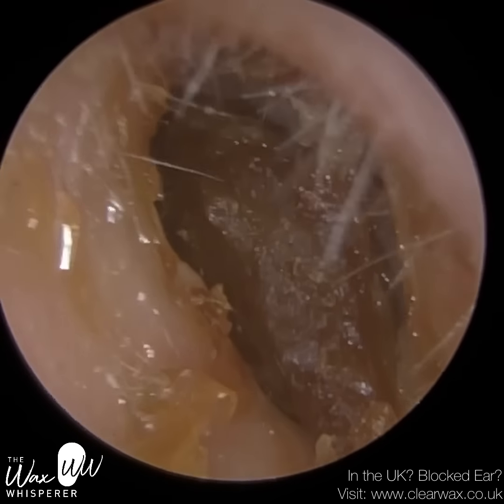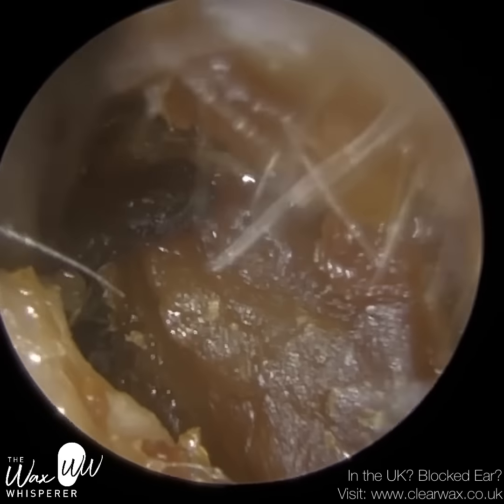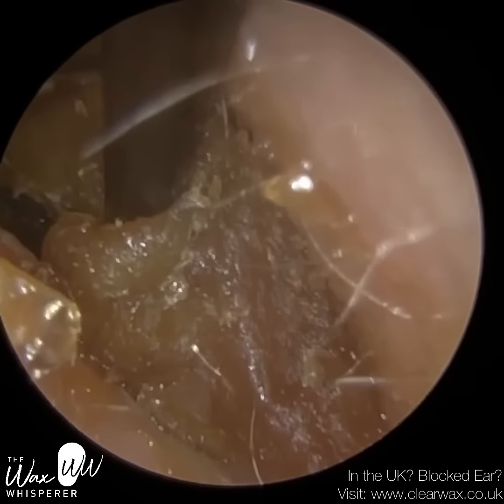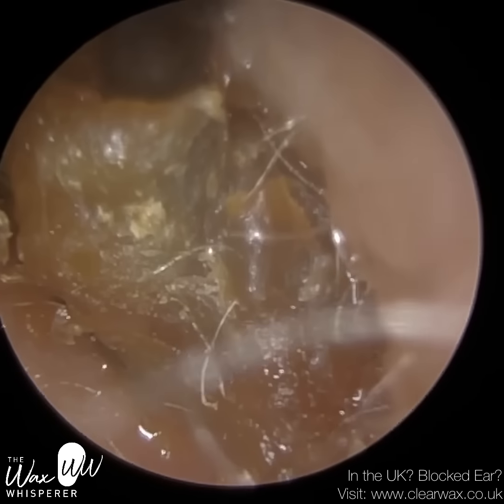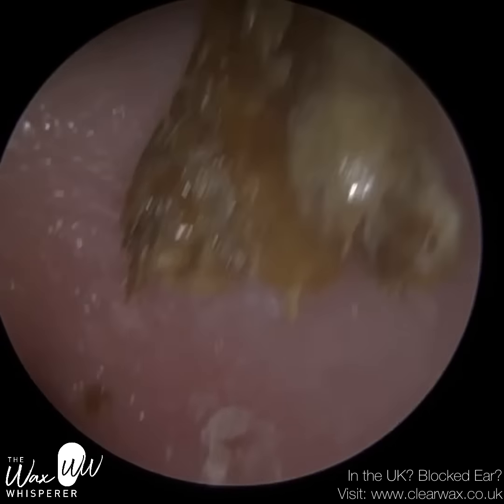I'm inserting an ear hook now, and I'm just going to embed the tip into the core of this hardened plug. I want to get a bit deeper, and then slowly bring this out. I was hoping that when I extracted this plug of dry wax and keratin dead skin, it would come out in one big piece — and that was quite a substantial piece there.